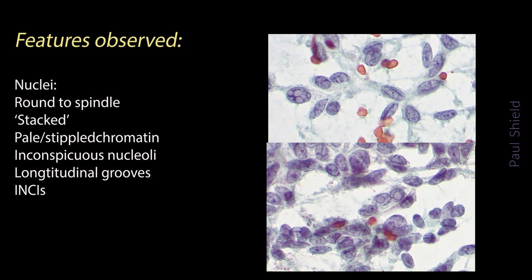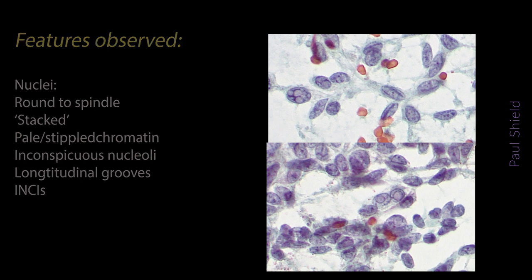In terms of diagnosis, medullary thyroid cancer was certainly the most likely. It lacked any follicular pattern, and there was a lack of papillary architecture present, even though there were some papillary-like nuclear changes present. The nuclei, however, really fitted with neuroendocrine cells. They varied from round to oval. The chromatin pattern and absence of prominent nucleoli fitted with that as well.